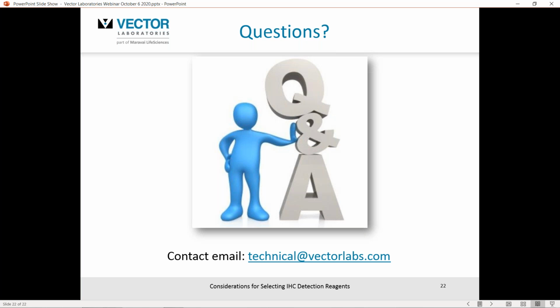All right, thank you, Craig. The last question is, can I use a universal secondary antibody, for example, anti-mouse and anti-rabbit, on rat tissue? The quick answer is yes, but you want to be a little aware of the fact that the anti-mouse component of that universal antibody would have some percent of cross-reactivity with rat IgG. Now, if the tissue itself doesn't exhibit any detectable IgG, then there wouldn't be a concern in applying that.